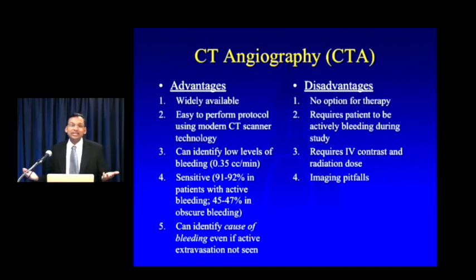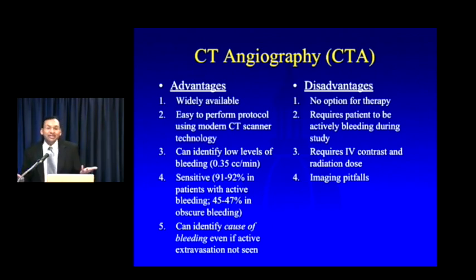Now, like any test, there are disadvantages, but I think they're relatively minor. Yes, there's no option for therapy. Yes, it carries the risks associated with IV contrast and radiation dose. And optimally, you have a patient who's actively bleeding during the study. But I think the biggest disadvantage of the study is when you have a radiologist who's reading the study who hasn't looked at many of them and isn't familiar with some of the pitfalls.